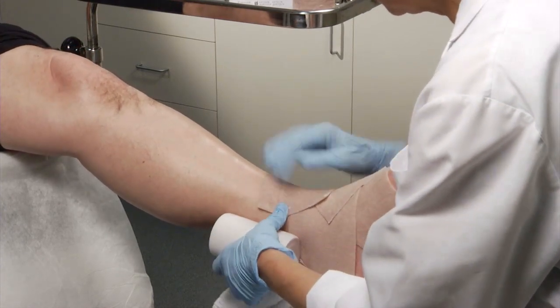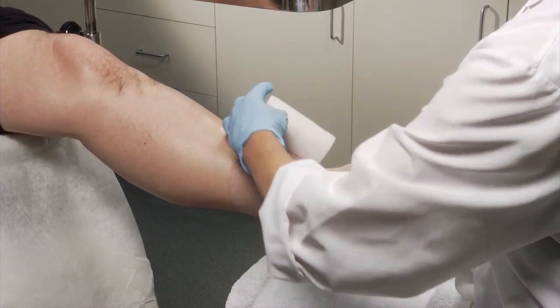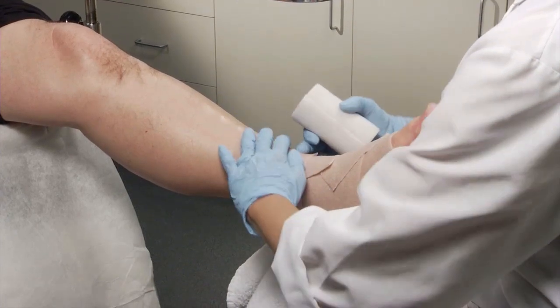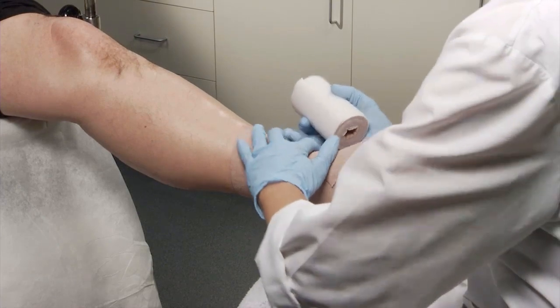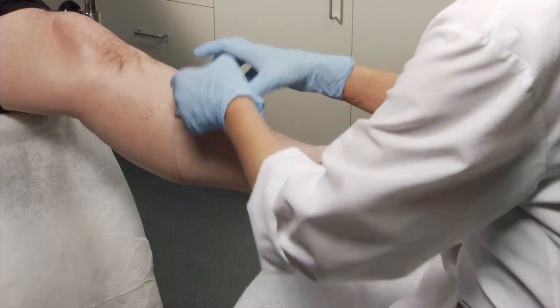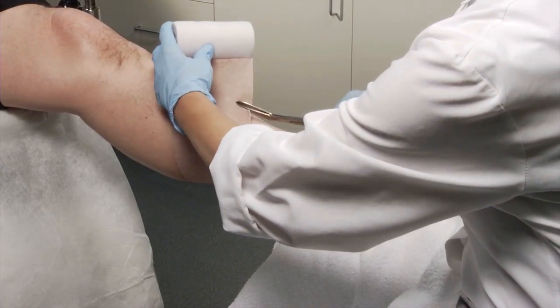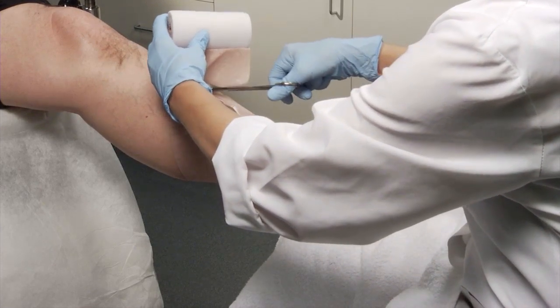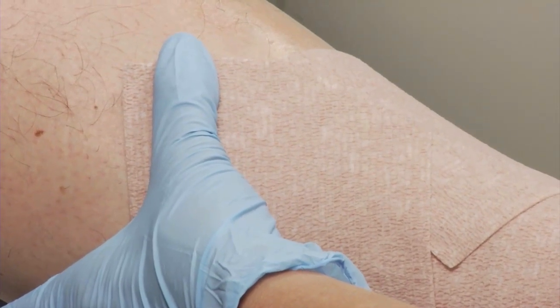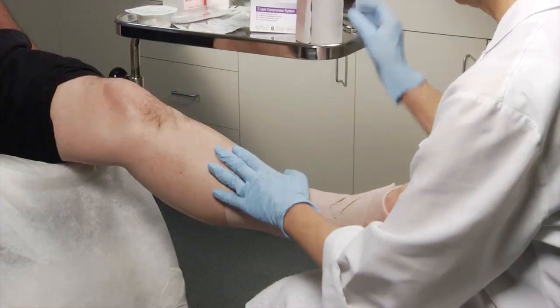With minimal overlap, bring this layer around the ankle and cut it when it overlaps the underlying material. Proceed up the leg with individual windings and minimal overlap until a circular application is possible, applying with just enough tension to allow the comfort layer to conform to the leg contours. Press to conform each winding — tape should not be necessary. By applying the material in individual pieces, you can see how the bandage conforms smoothly to the anatomy without any gaps or bunching. This direct skin contact provides optimal mechanical adherence of the comfort layer when compressed against the skin.